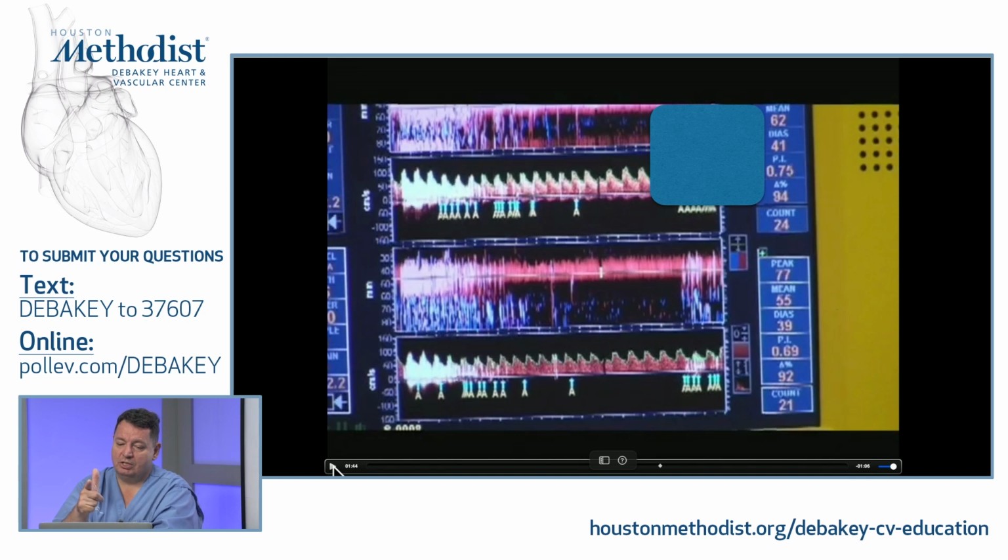Make sure the injection is in, and I'm getting information. I'm getting the information that without any Valsalva, I have a shower already. That is telling me I don't need 2 injections, I only need 1 injection. My single injection shows both results. My result is with and without Valsalva on 1 injection. So right now, what you see on the screen, I didn't do any Valsalva. It's a positive study with the shower.